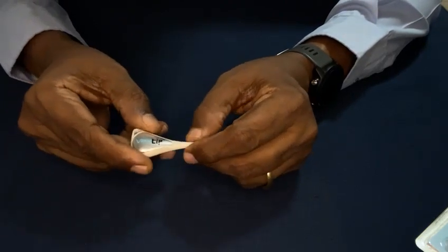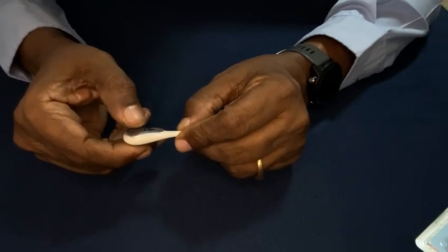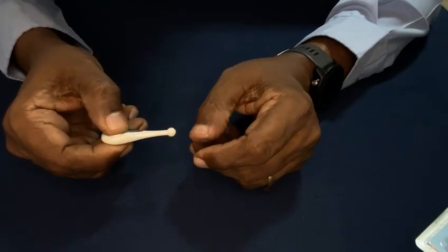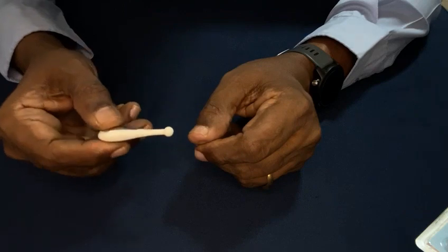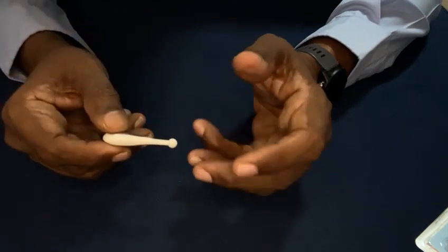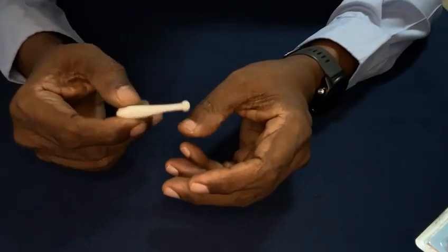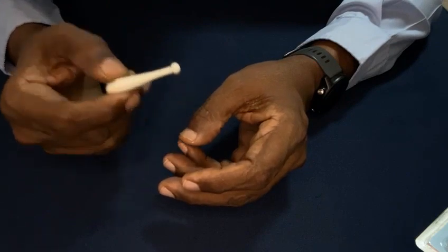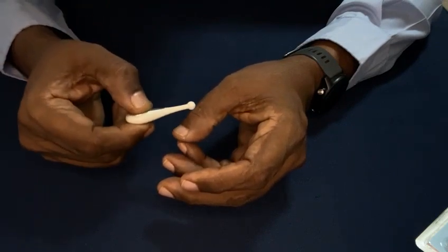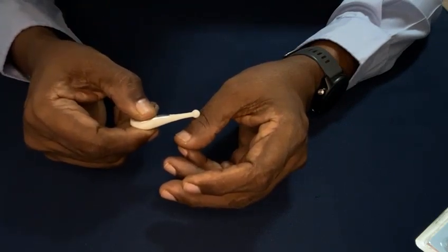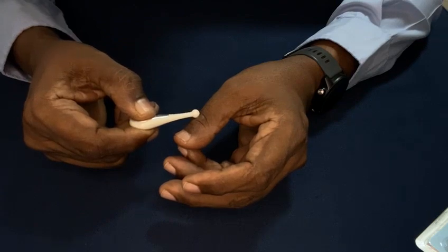The major precaution you have to take is you should not keep pressing it for a long time, because unnecessarily you are draining the battery. So whenever you are testing, suppose you are doing a testing at the great toe, you keep on the toe and then press it for a second or two, then release it.